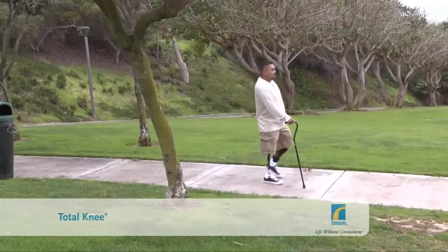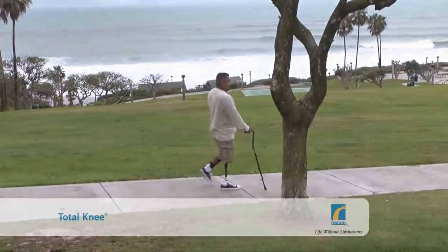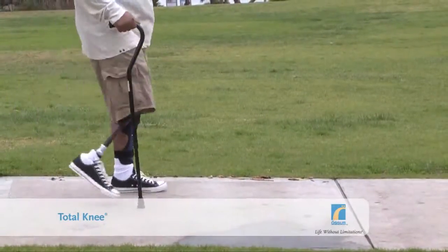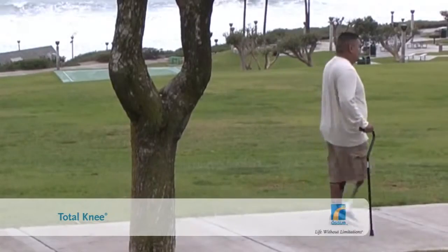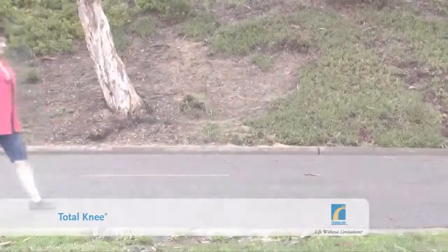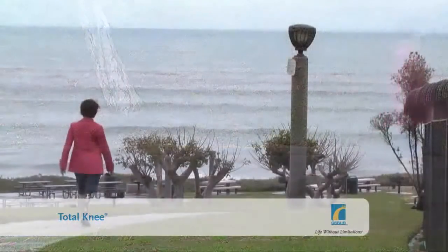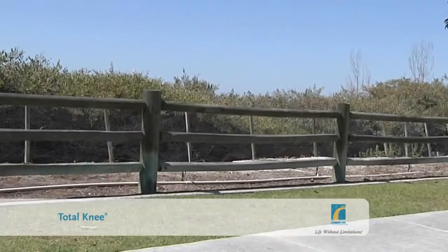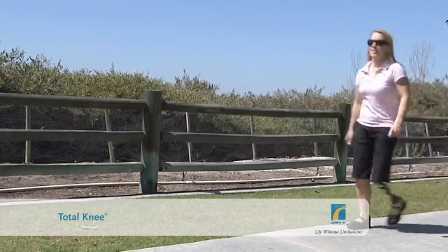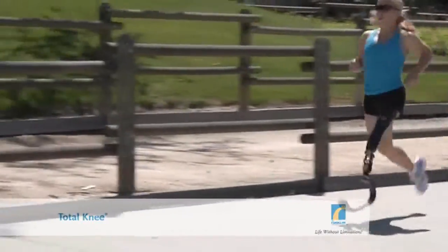Please note, the Total Knee 1900 is designed for individuals who tend to walk at a slower, more constant speed, possibly using a walking aid. Total Knee 2000 is for those who are able to walk at different speeds, including fast-paced walking. Total Knee 2100 is for those who have a very dynamic gait at different speeds, are heavy in weight and do sports.